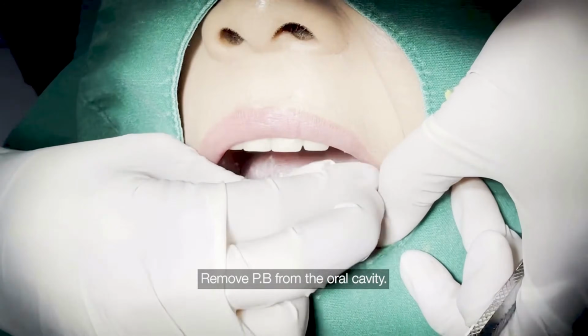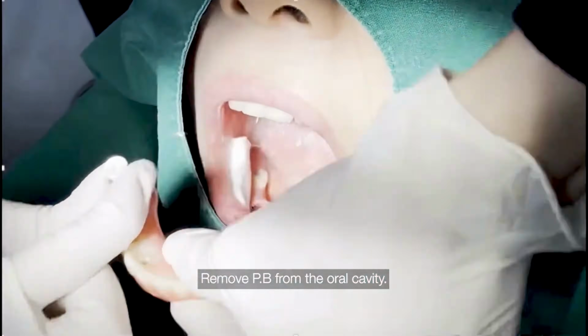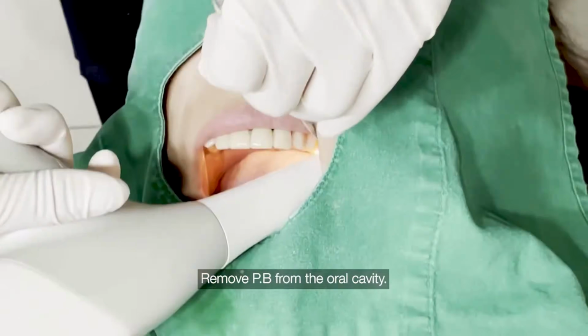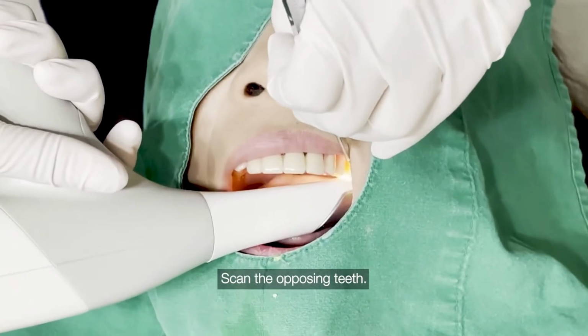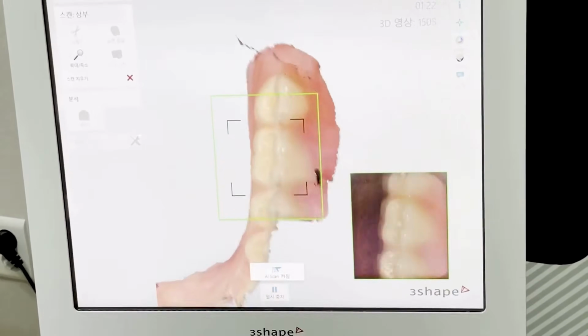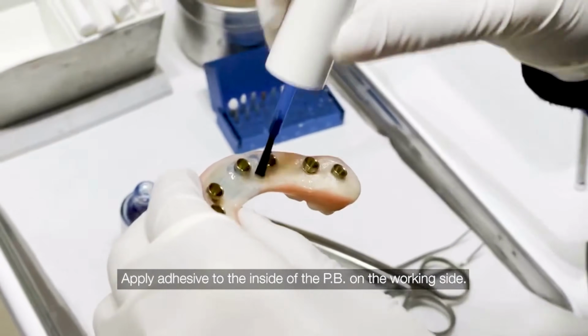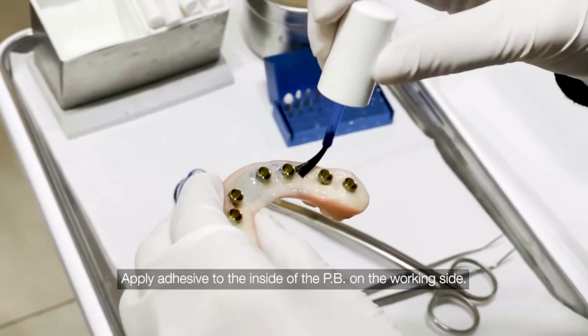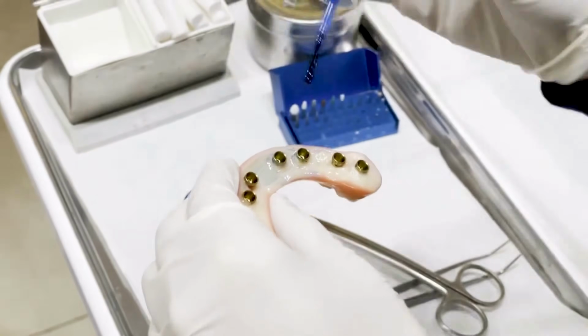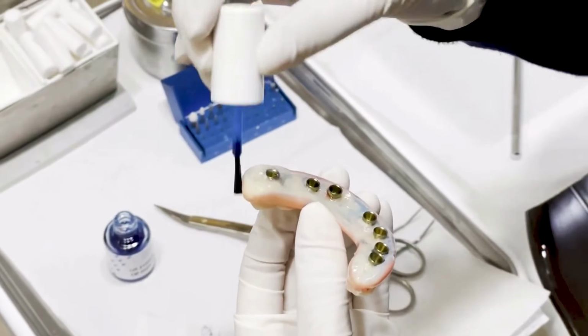Let's scan. What is it? Today we talk about the cylinder scan body, a digital scan body used in implant dentistry. It is called a reverse scan body because we scan the prosthesis instead of scanning the implants directly. This digital scan body records the exact implant position.